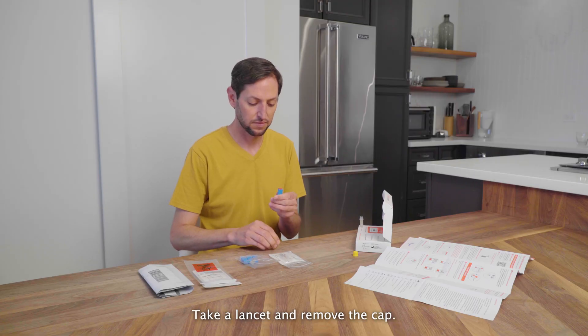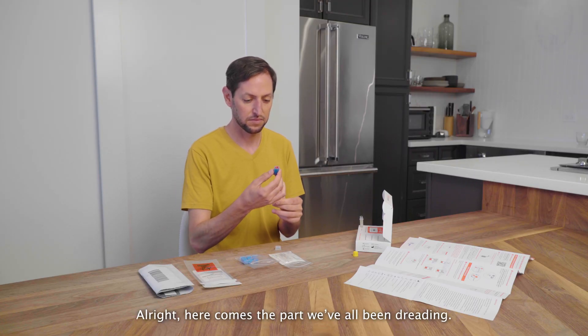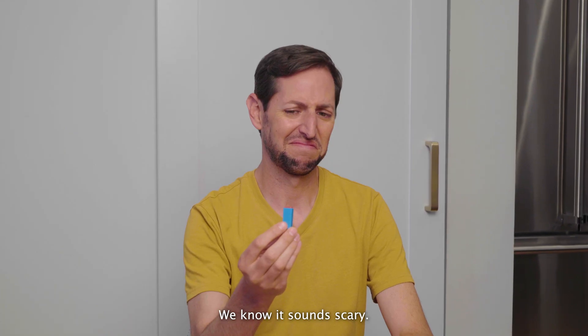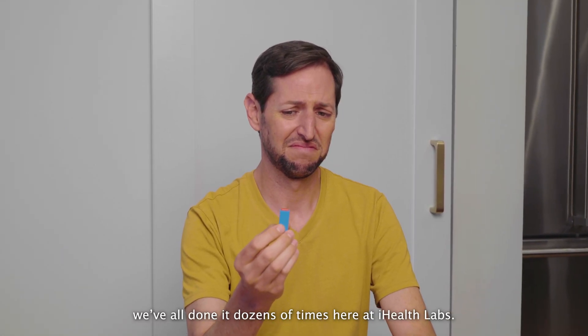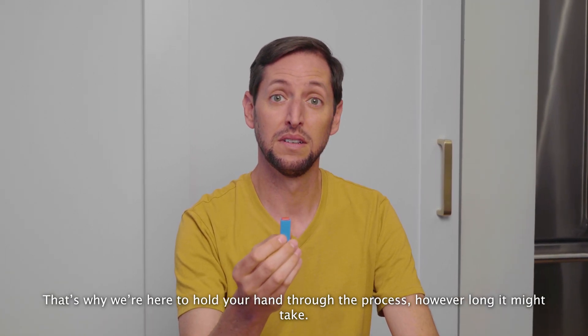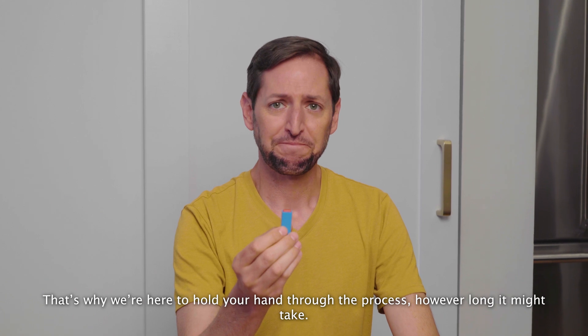Take a lancet and remove the cap. Here comes the part we've all been dreading. We know it sounds scary. We've all done it dozens of times here at iHealth Labs. That's why we're here to hold your hand through the process, however long it might take.